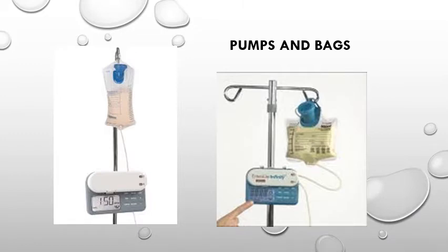When using a feeding pump, the licensed delegating nurse will provide DD personnel with specific information regarding continuous tube feeding or intermittent feeding, including specific information about using the pump. The instructions will include the type of supplement, amount of supplement per hour if the feeding is continuous, or if the feeding is cycled, start and stop times. Also, times and amounts of tube flushes and times of medication administration.